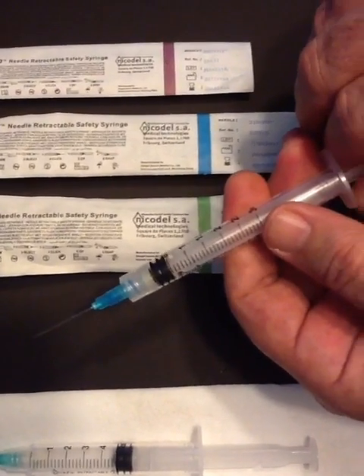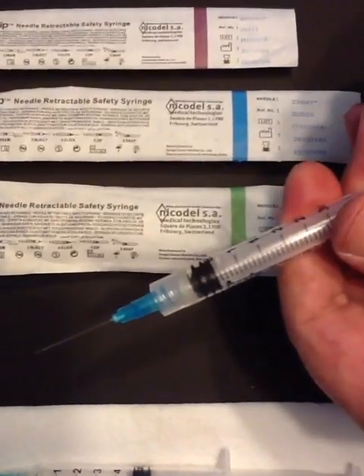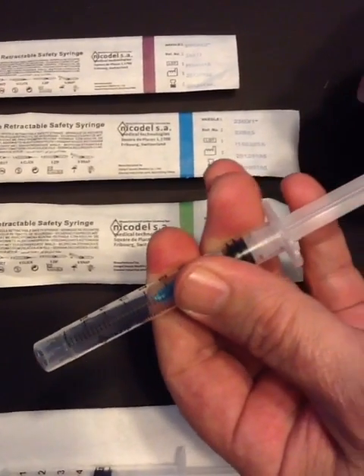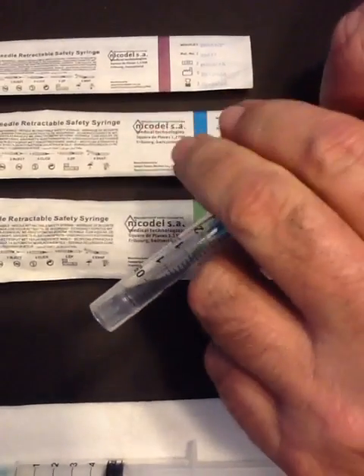The needle is now locked so you can pull the plunger until the end of the barrel. Break off the plunger.